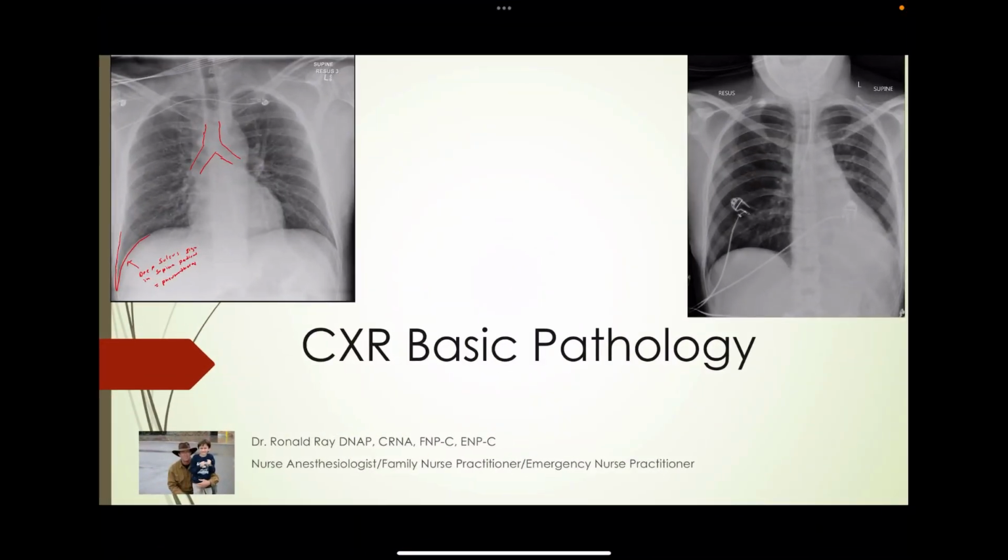Hey all, just a quick podcast here to go over some basic things on chest x-ray. This one's going to concentrate on line placement, intubation, and pneumothorax. So hope you enjoy it.